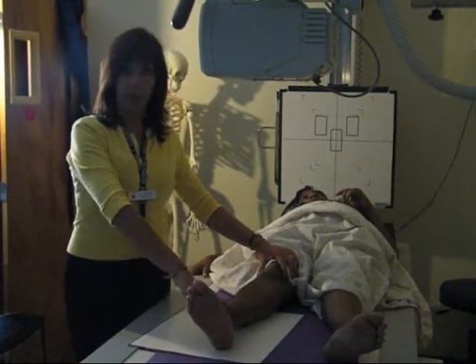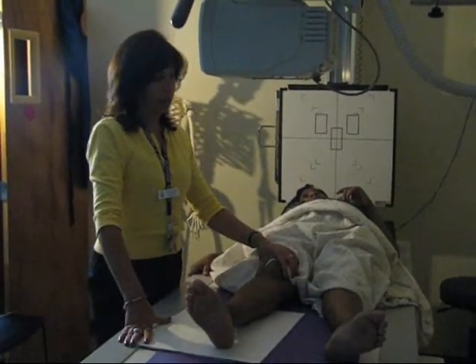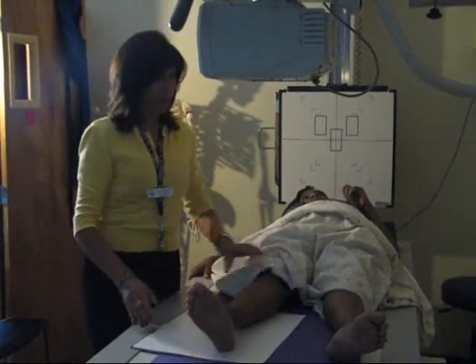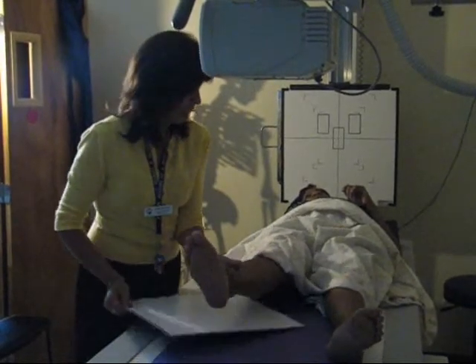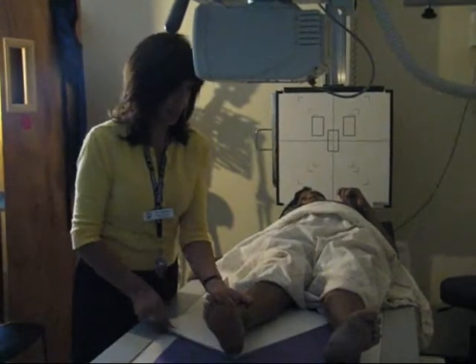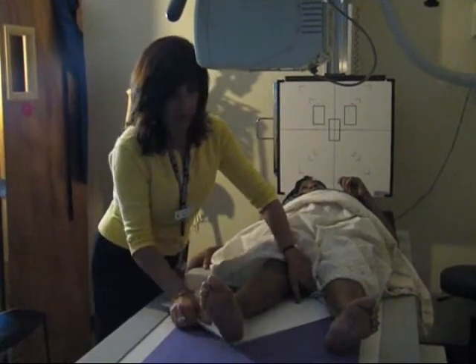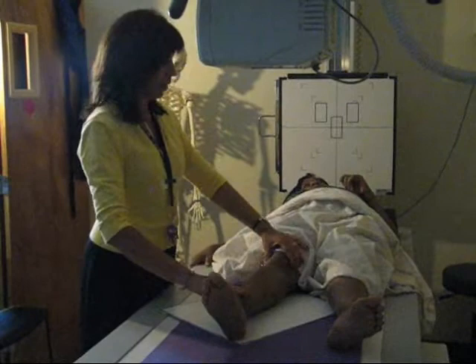For most people, a 14 by 17 cassette is not long enough to accommodate both joints in the same film. So we have to kind of catty corner our cassette in hopes that we can accommodate both joints.